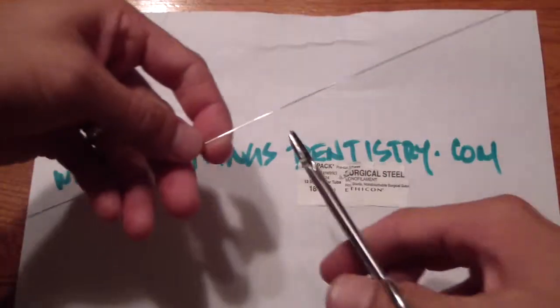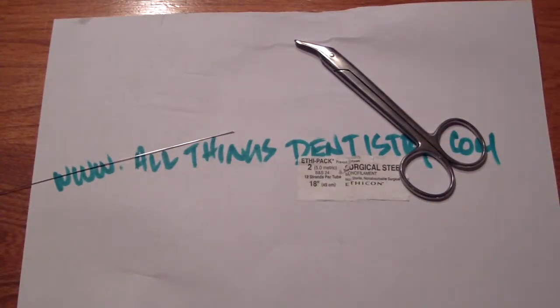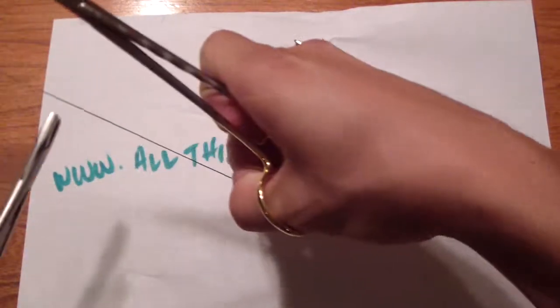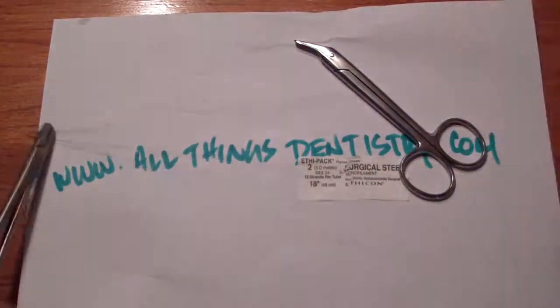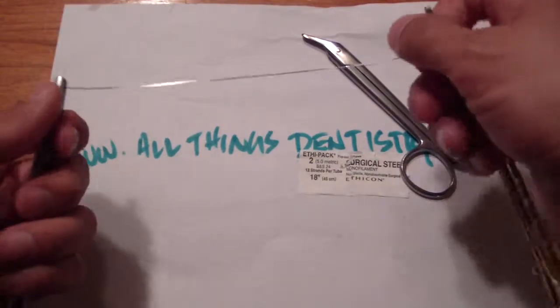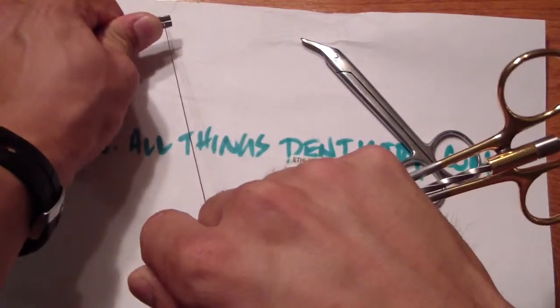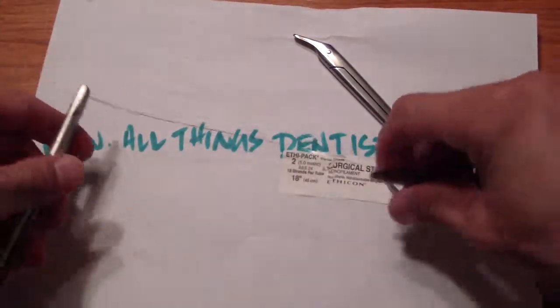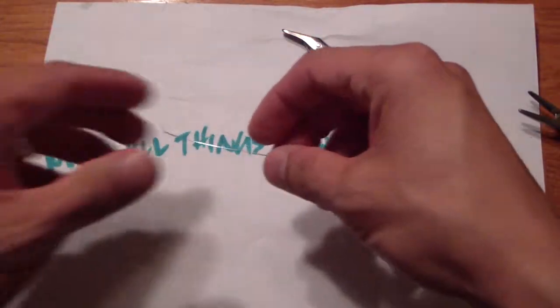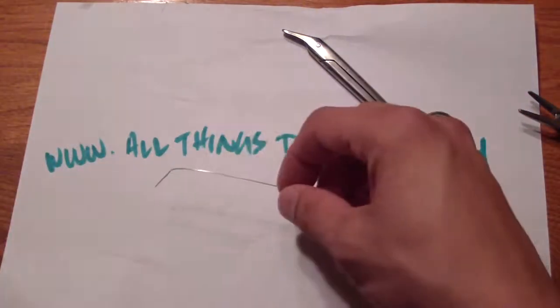Clip it there. One of the key things you can do — and everyone's different — is to stretch the wire a little bit. You don't have to, but it may help prevent further stretching, because we're going to be putting a lot of force onto this. So just stretch it a bit with a hagar — there's just some of the slack.